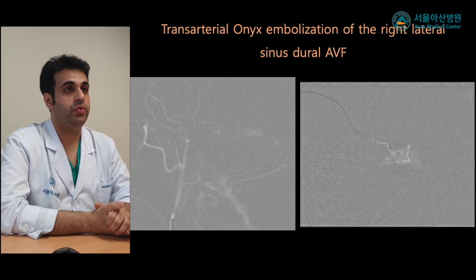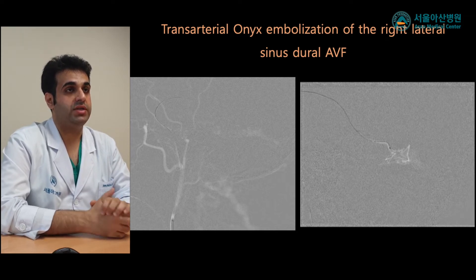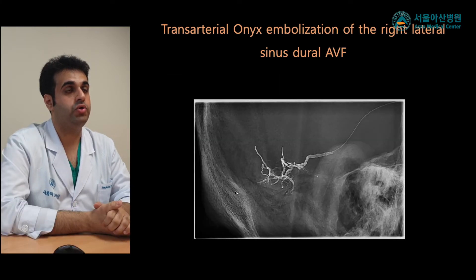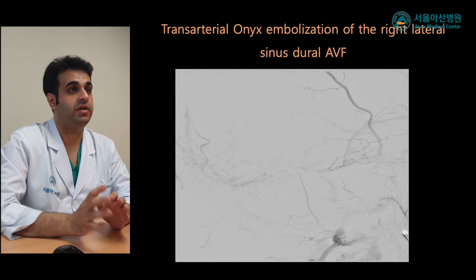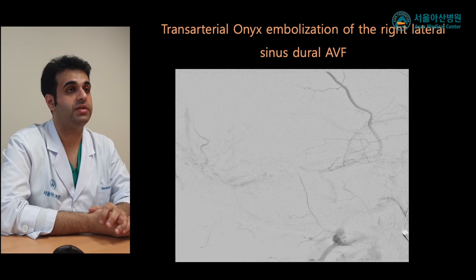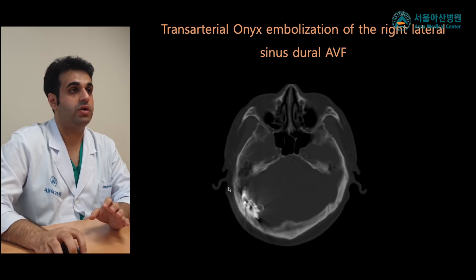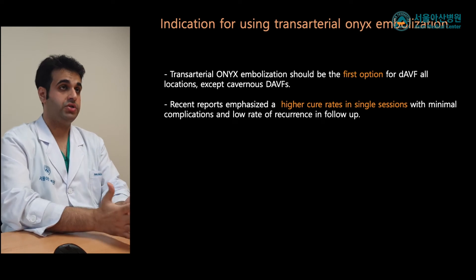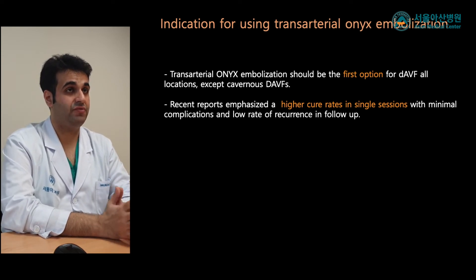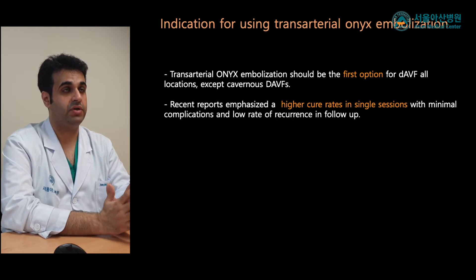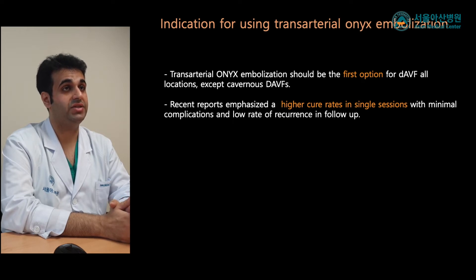We navigated through the middle meningeal artery on the right side and performed continuous Onyx injection under fluoroscopy, achieving complete obliteration of the fistula. The final run demonstrates complete obliteration of the lateral sinus dural AV fistula. Follow-up imaging demonstrates the site of Onyx injection. Transarterial Onyx embolization should be the first option for dural AV fistula treatment in all locations except the cavernous dural AV fistula, with recent reports emphasizing high cure rates in a single session, minimal complications, and low recurrence.